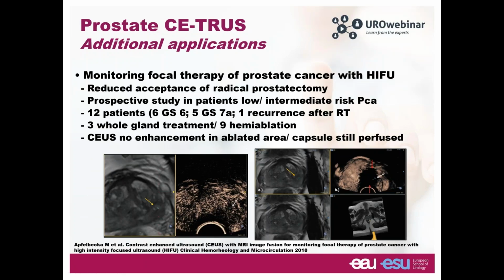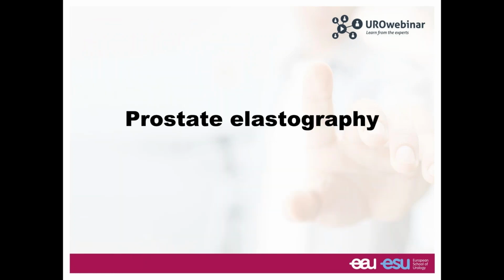It is useful to monitor focal therapy with a HIFU or cryoablation, and there are a few papers now coming to demonstrate the value of this application. The next topic is prostate elastography.